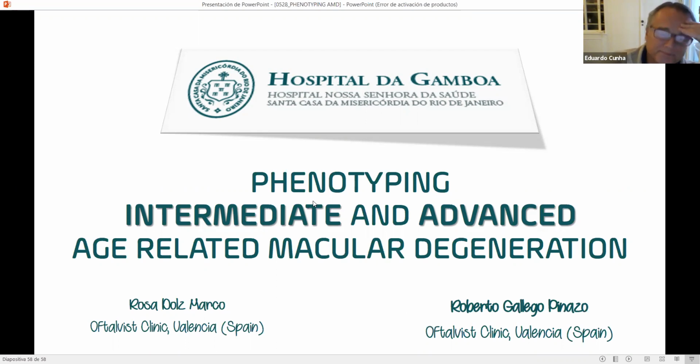We used this term because at the beginning Dr. Moniz hypothesized that maybe it's a swelling of the Henle fibers, but it's not really an edema. But in fact, the true term, as it was described, was hyporeflective wedge.